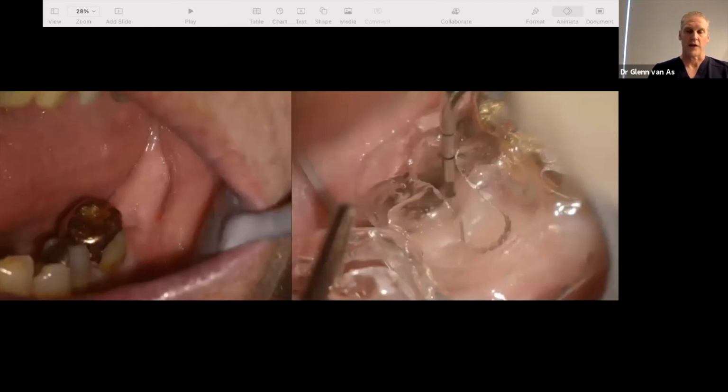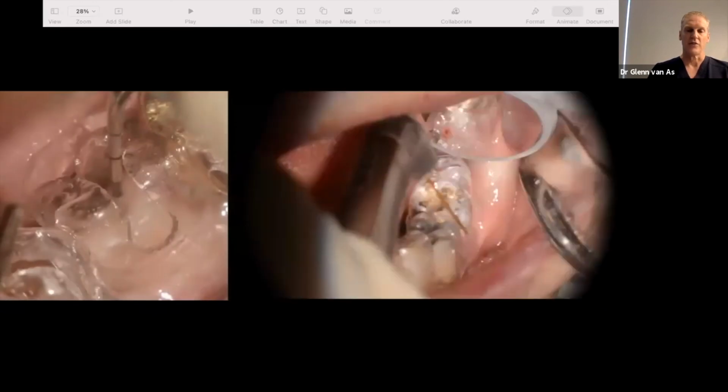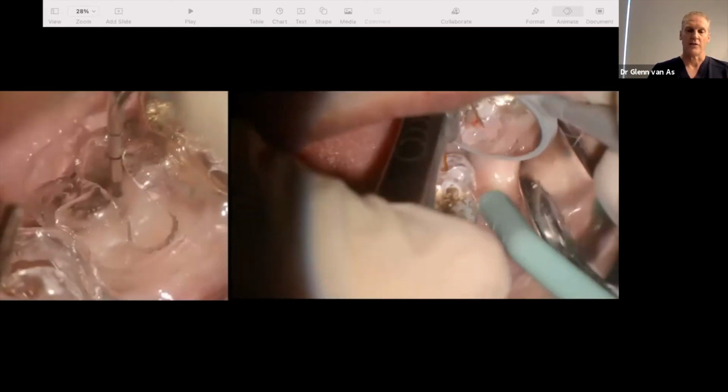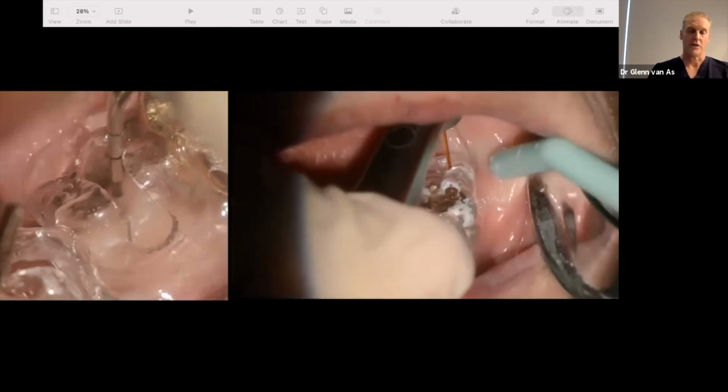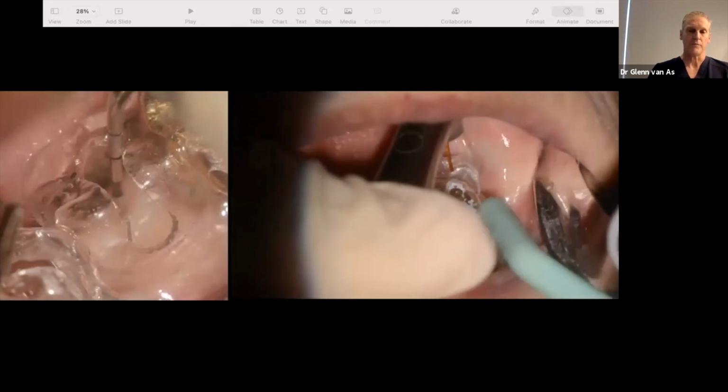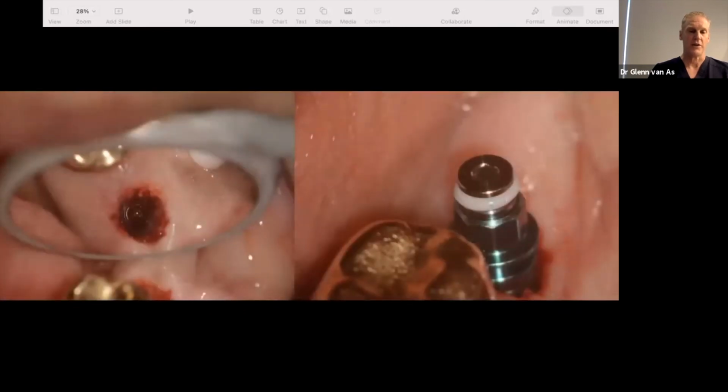So in this case that I talked about, the patient came back 3 months later, and this is in the old days before guided surgery. We did this case flapless, but we punched a hole through an Essix retainer. I actually used the laser to create a little site, and then I removed the tissue, not with a tissue punch, but with the laser, as you see here. We did the osteotomy through this. This is before guided.